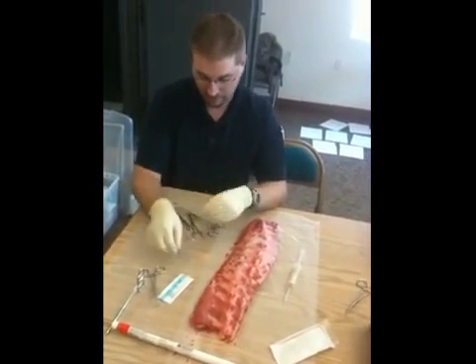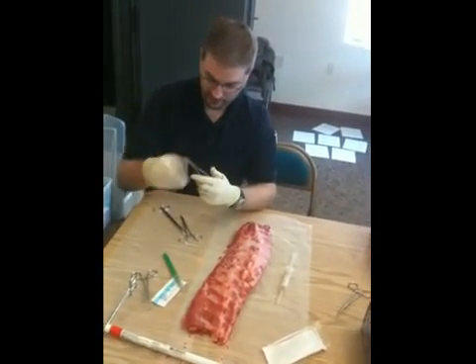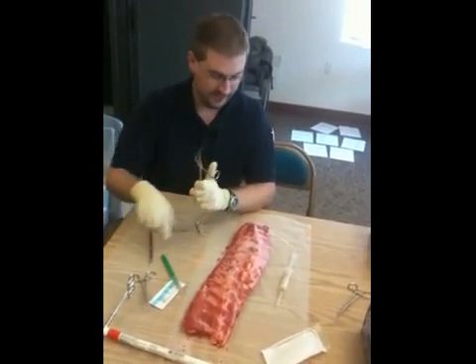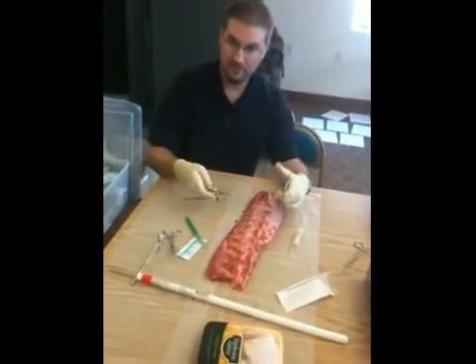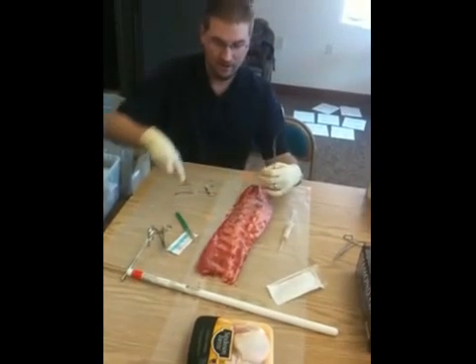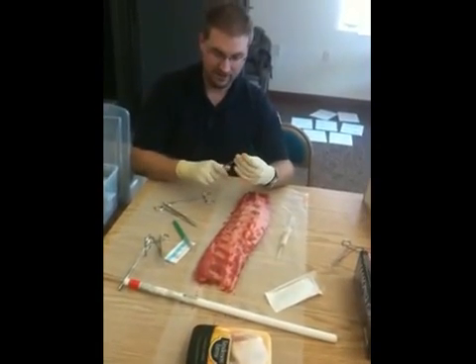You want to go ahead and have a scalpel, a large set of curved forceps, and then some scissors as well. The first chest tube I ever did, I actually screwed it up a little bit — I made a tiny little incision. It was a trauma and I ended up having to cut it down a little bit. So definitely make a good incision the first time.